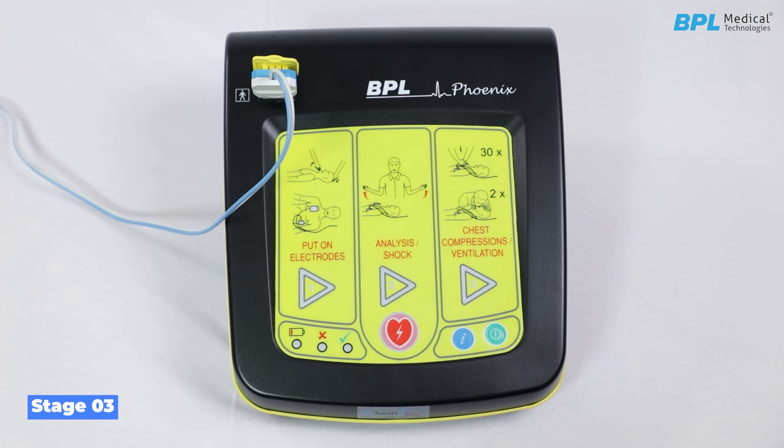Stage 3: chest compressions and ventilation. The device is now in stage 3. The workflow triangle LED 3 lights up. Administering 30 chest compressions must begin immediately after the above voice prompt is heard: shock not advised, patient may be touched. Carry on resuscitation — alternately give 30 chest compressions and 2 mouth-to-mouth breaths.